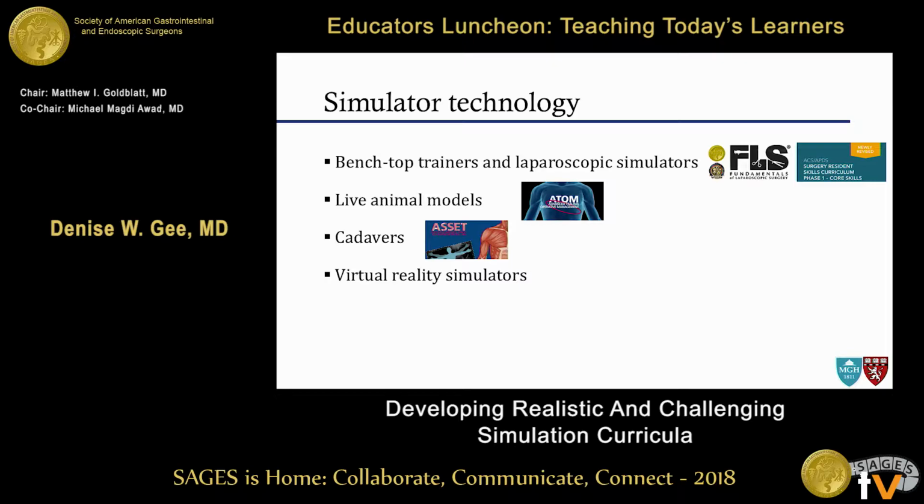Virtual reality simulators, this is the basis of the FES curriculum using the GI Mentor, as well as robotic curricula with the Da Vinci simulator. These have really come on the market. They help residents and trainees develop hand-eye coordination. A lot of them have full-on procedures that you're able to practice. It offers metrics right then and there on accuracy, et cetera.